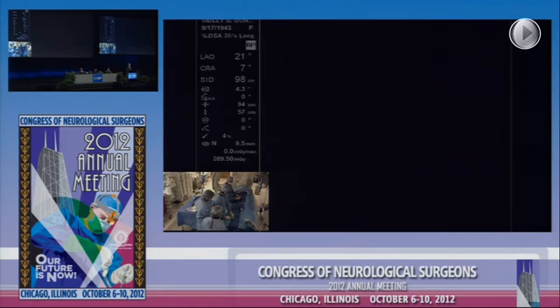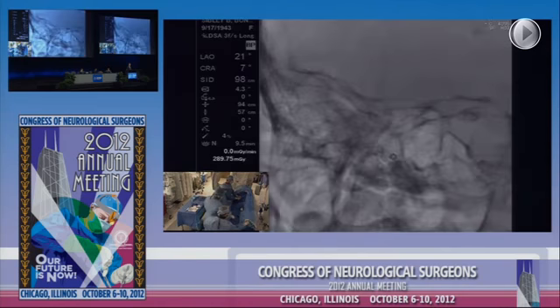So you've got a triaxial system? Fluoro, please. So we have a triaxial system. We have a Marksman and a Reflex, which is very flexible, in a standard Cook shuttle, which is a very heavy guiding catheter, which we usually use for carotid stenting.